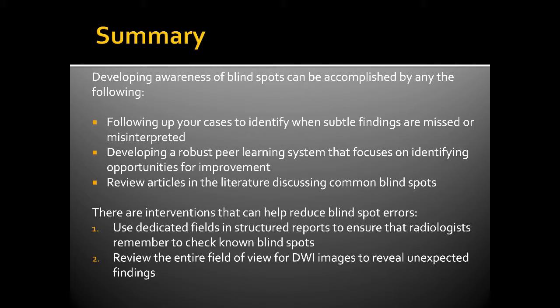There are interventions that can help reduce blind spot errors. Use dedicated fields and structured reports to ensure that radiologists remember to check known blind spots. And review the entire field of view for diffusion-weighted images to reveal unexpected findings.